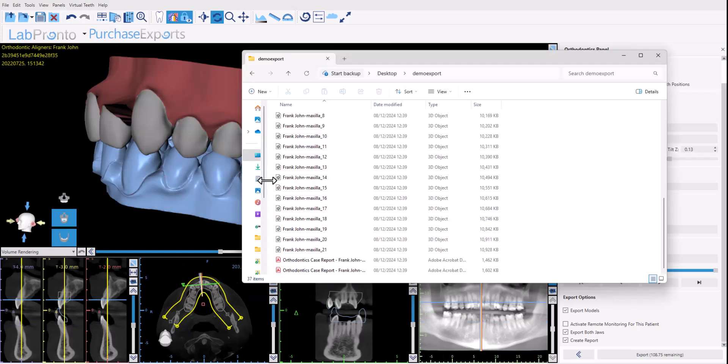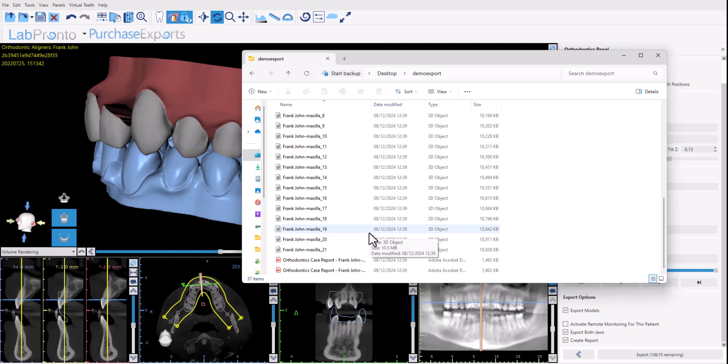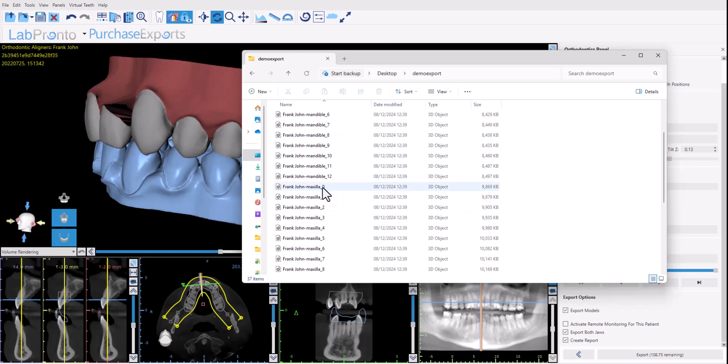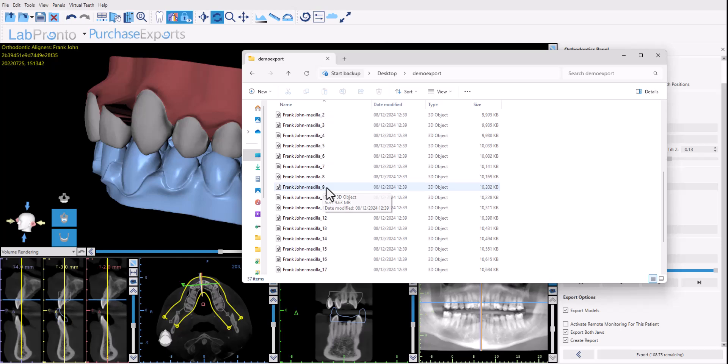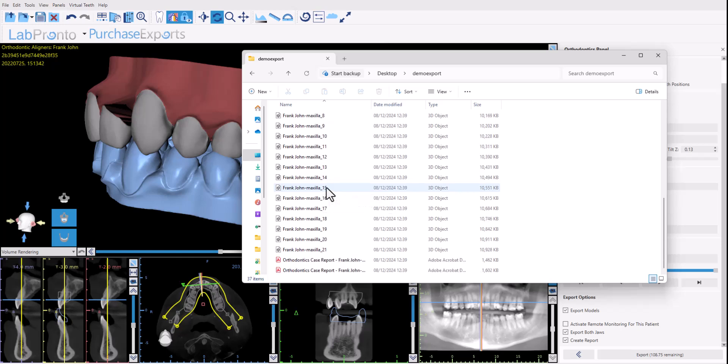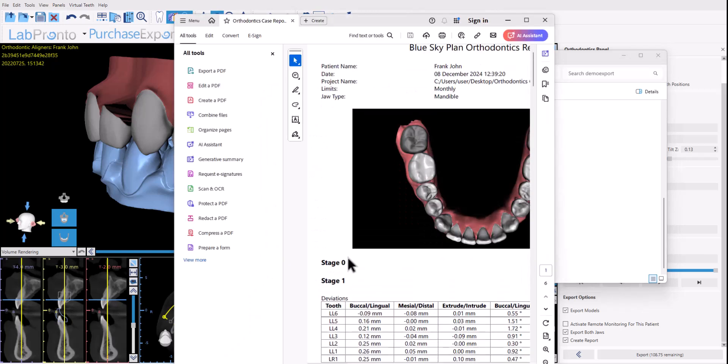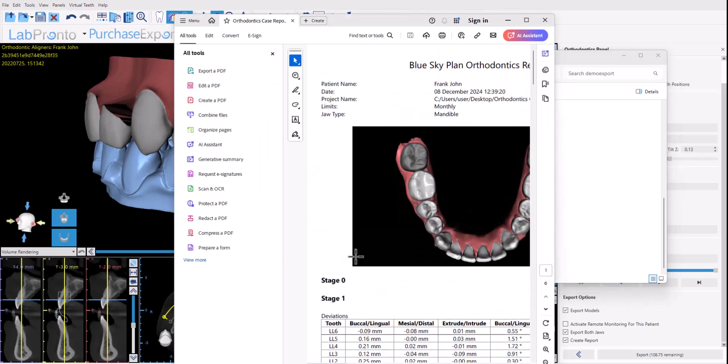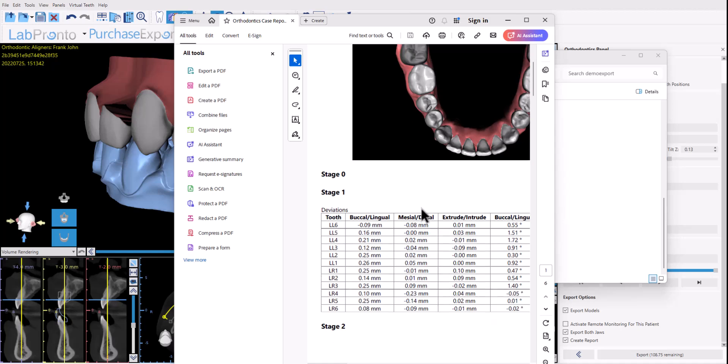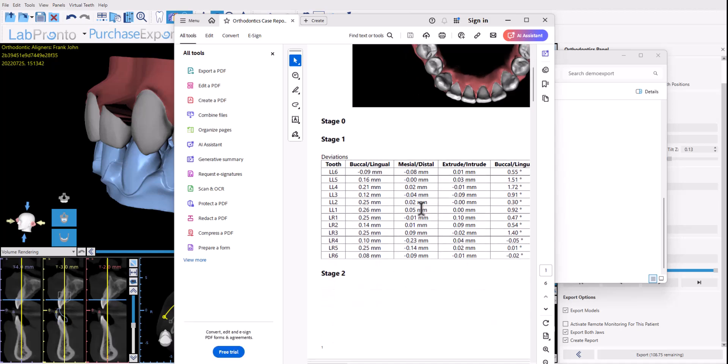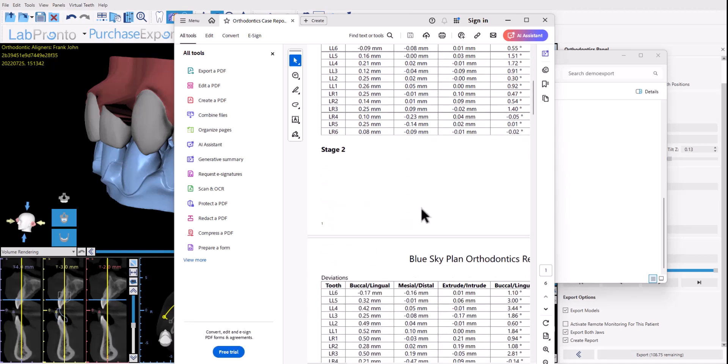If we now look in the folder at the files that were exported we could see for each stage we have an upper and a lower model that was exported. We also have a model at position zero at the start position. And if we scroll down further we could see the case report that was created, a separate report for each jaw that contains an image and relevant IPR information when there is, and movement information as well.